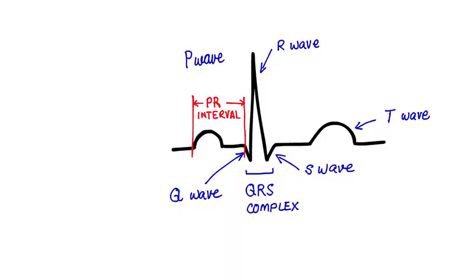So let's talk about some of these intervals. For example, just one exception before, QRS complex is sometimes called QRS interval, and it is really three waves and there is no straight line. So that is one interval that is an exception. Now let's look at the intervals in the correct order. PR interval includes the P wave. It measures the time from the beginning of the atrial depolarization to the beginning of the ventricular depolarization.